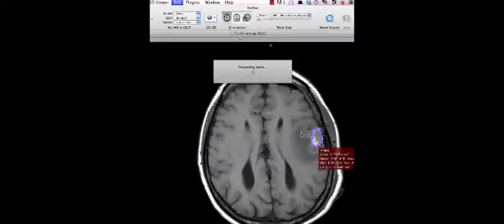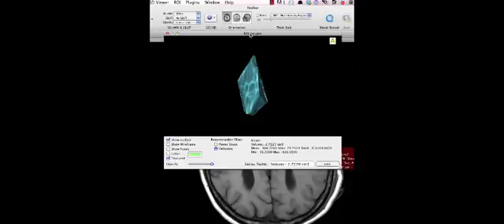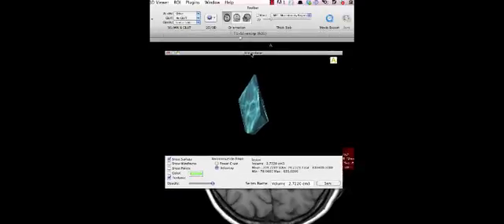Now click compute volume. And it is creating the volume. The volume of the lesion that I marked out is about 2.7 cm3. And this is the image. And this is the 3D image of it.